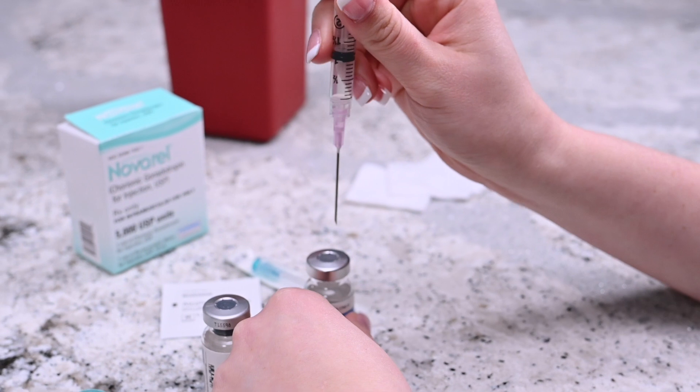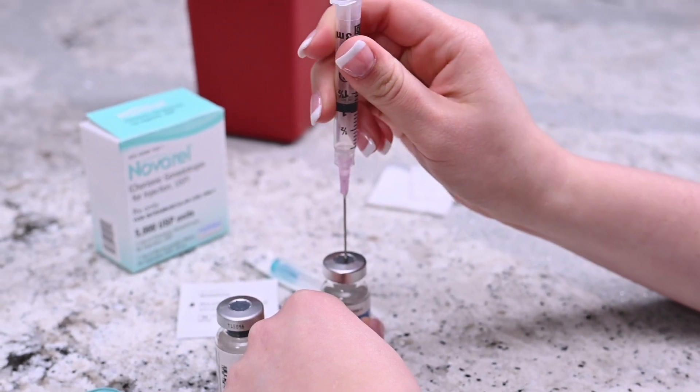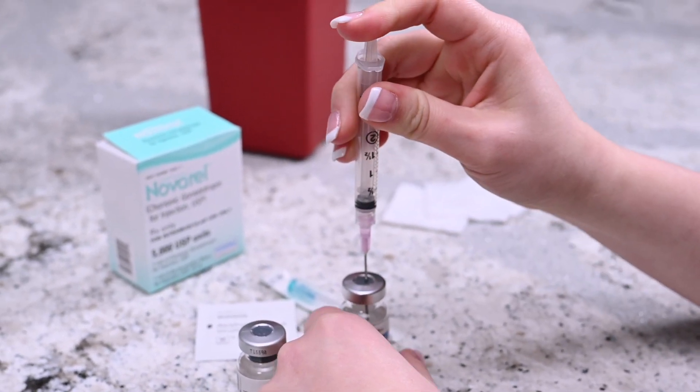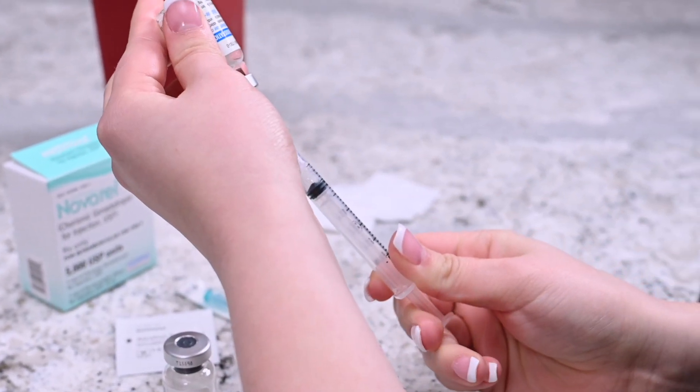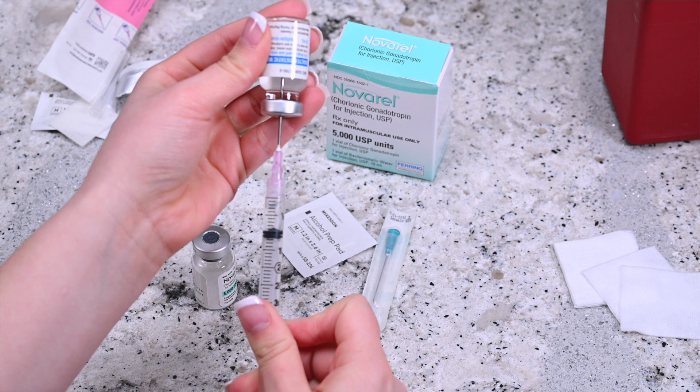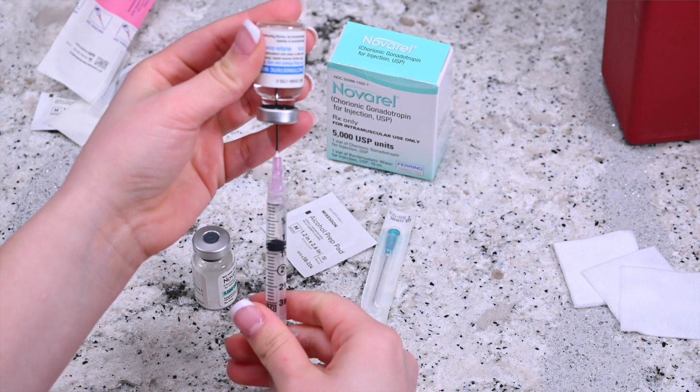Insert the needle into the center of the Navarol solvent vial and push the plunger down until all the air enters the vial. Invert the syringe so that the vial is upside down but still attached to the syringe. Make sure that the medication submerges the tip of the needle.